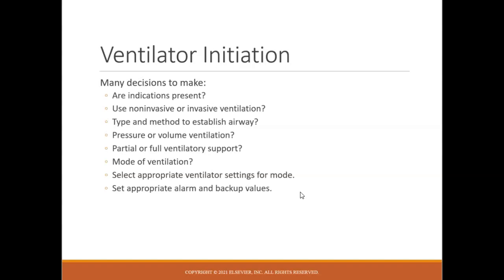My goals for ventilation will be different depending on whether they're being intubated because of an oxygenation issue, which typically is related to shunting, which we remember from the last lesson. Shunts are where we have perfusion going to underventilated alveoli. So to treat this oxygenation issue that's requiring mechanical ventilation, I need lots of PEEP, and typically I'm not going to be able to apply very big volumes at the beginning, right? Because it's usually due to decreased compliance. So in that scenario, I'm going to be picking faster rates, lower volumes, higher PEEPs.